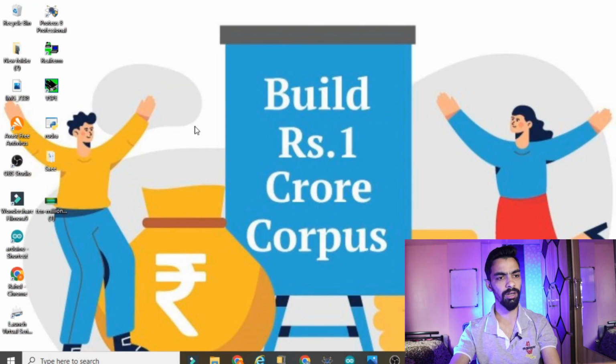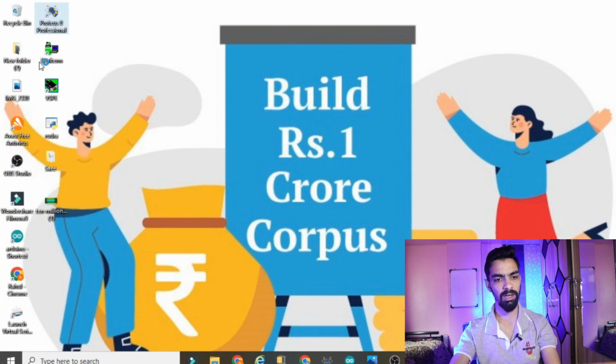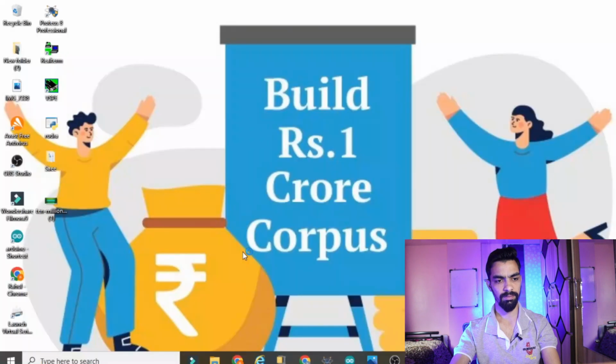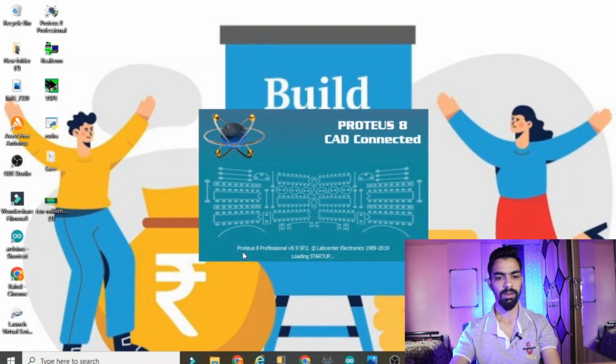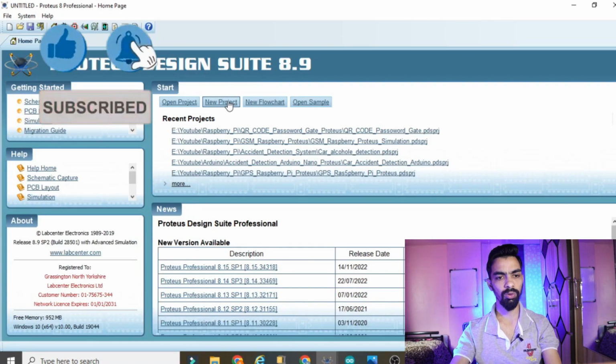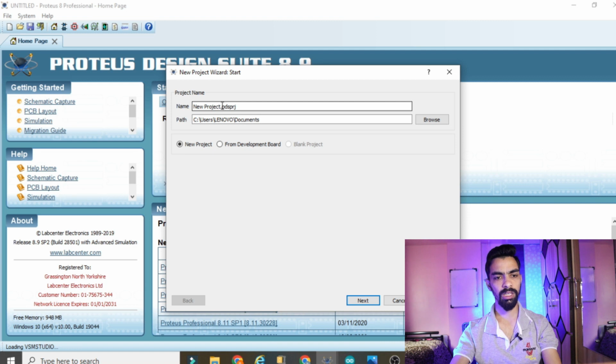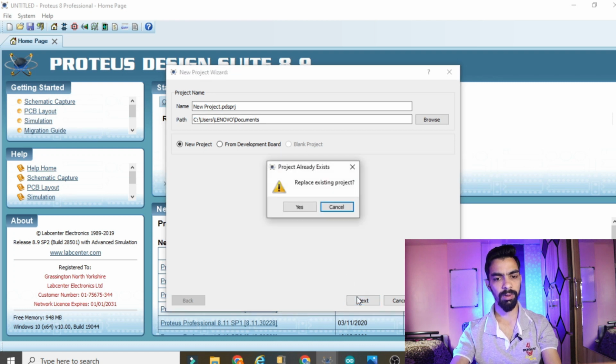Okay, once you install the Arduino Proteus library, now open the Proteus 8.9 software. Right click here and run as administrator. Click on the yes button. Then wait for some seconds, your Proteus 8.9 software will open. Then go to New Project. Then you can give the project name whatever you want here, and wherever you want to save your project, that path you can give here. Then click on the next button.